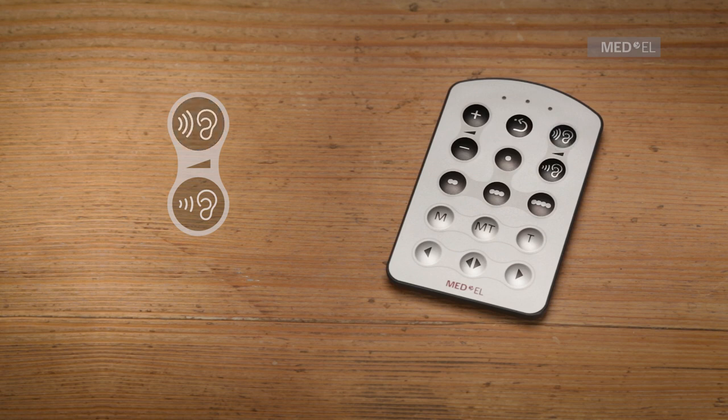To decrease the sensitivity of your audio processor's microphone, press the lower sensitivity key.